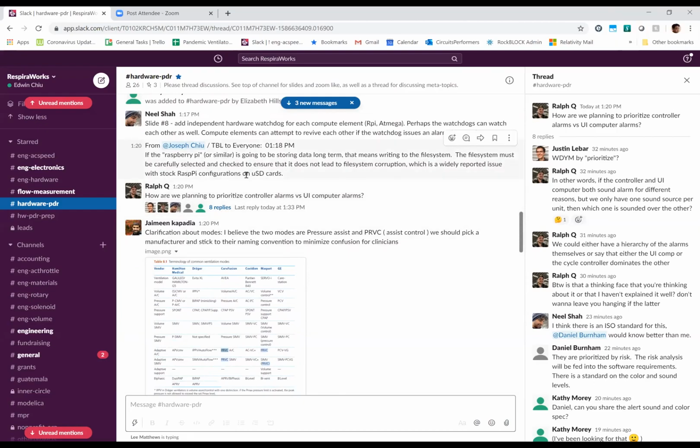Yep. Hey, Edwin, something Kyle brought up, which I raised in the last meeting, but it's a big topic that I think is worth broad awareness: the controller logic that we've been talking about, what's running on the Arduino, notionally by that logic breakdown, is actually pretty immature. As the hardware has developed and as we've been learning more about the medical requirements, we really don't have a good handle on it, and if someone feels they do, then definitely correct me if I'm wrong. That's why we've been reaching out to a lot of controls experts, to understand exactly what kind of control laws we need, what kind of state machine logic we need. That's a bigger gap that we identified later on than we would have liked. So that should be done first, and we need to make that a pretty high priority going forward. We're working on that and trying to do as much in parallel as we can without it.